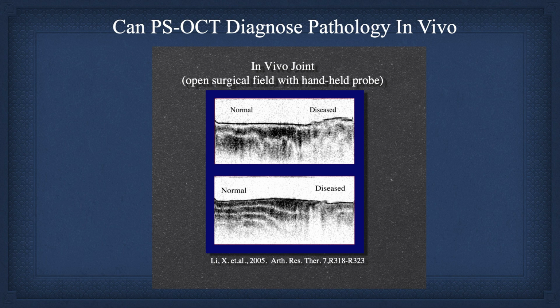So, okay, we've made a pretty strong case so far in testing our hypothesis. We need to test it in vivo. So how can we test it in vivo? In patients undergoing total knee replacement, we image, then they get the total knee replacement. We mark the cartilage, the cartilage is removed, and we send it for histopathology after we've imaged it and it's been removed from the patient.